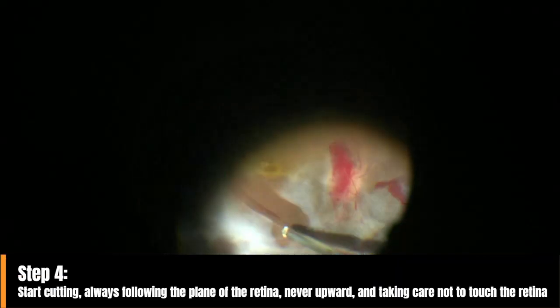Remember, never pull the membranes upward, always work in the plane of the retina. Do it carefully, always visualize in the same plane to avoid damaging other structures.